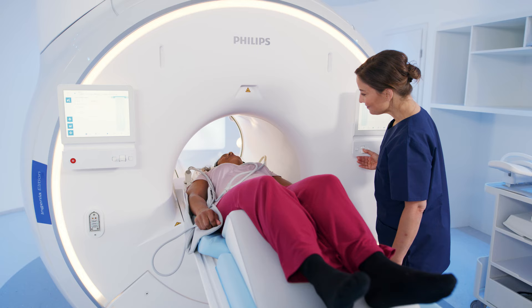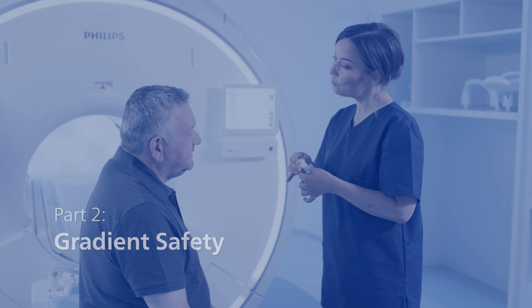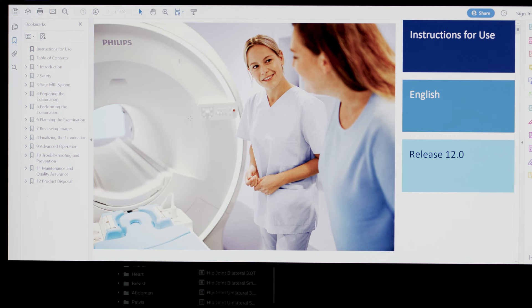This series presents the safety aspects of MRI systems. Magnetic safety presents the hazards inherent in the strong magnetic field of the MRI system. Gradient safety presents the hazards associated with fast switching gradients. RF safety presents the hazards associated with the radio frequency signal used to create detailed images.